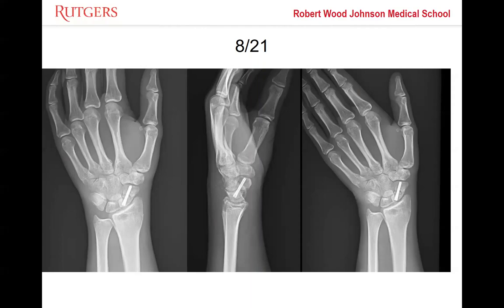Exactly. Yeah, I mean, I think in retrospect, that idea of getting a CT and looking for humpback, I didn't appreciate it as much on the lateral. And then I did it this way. And I think for these waist fractures, you can either go dorsal or volar. Personally, I like dorsal just because I can get that screw center. And I don't have a problem just kind of working up and filling it in with graft that way.